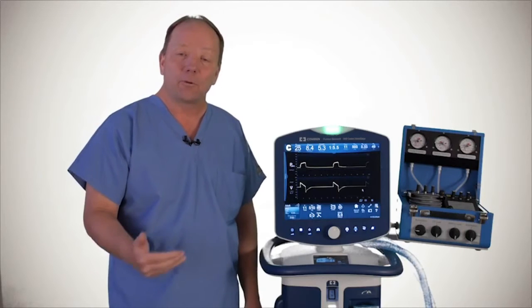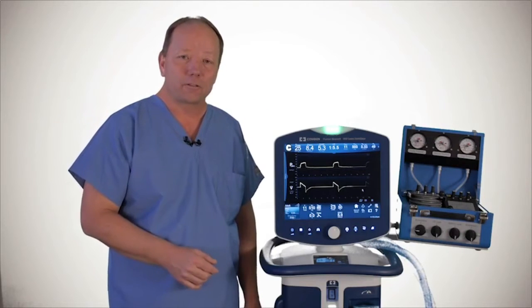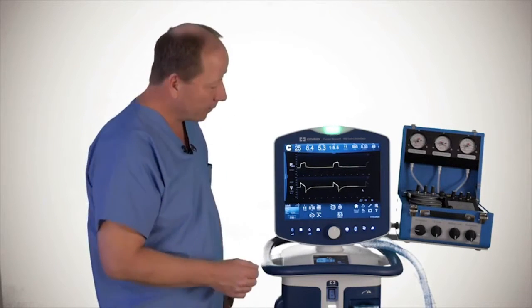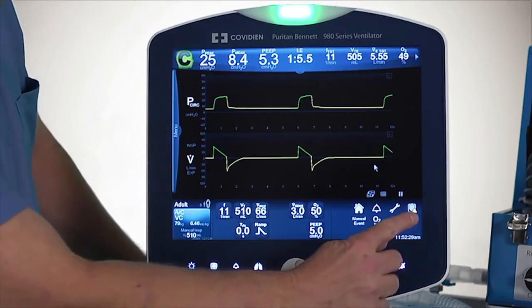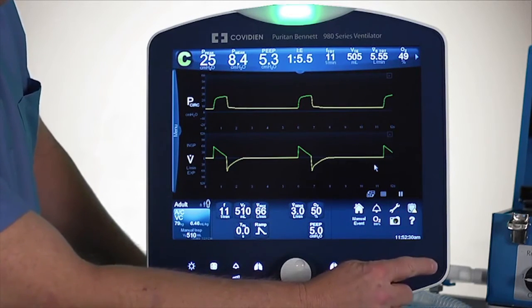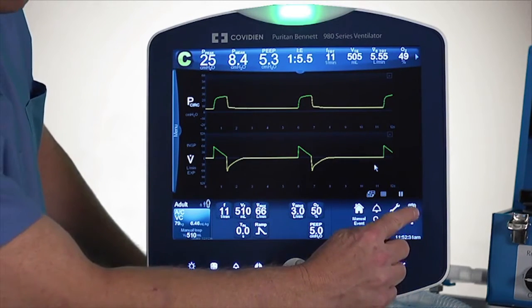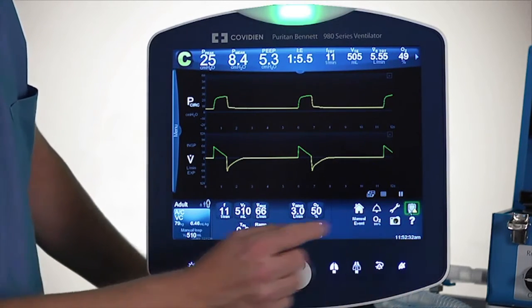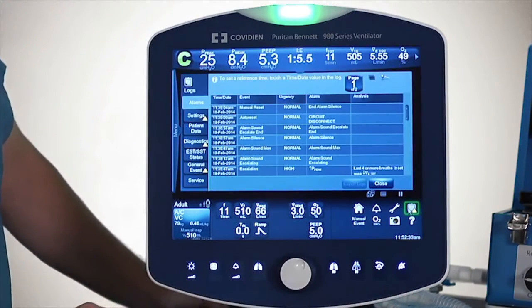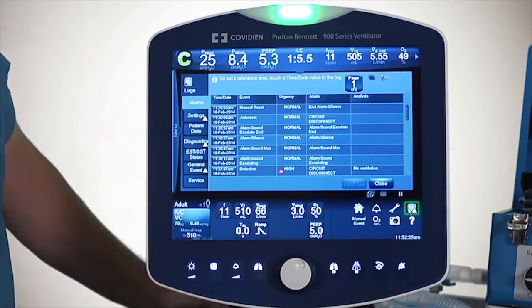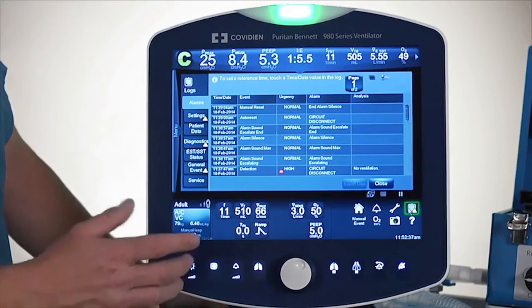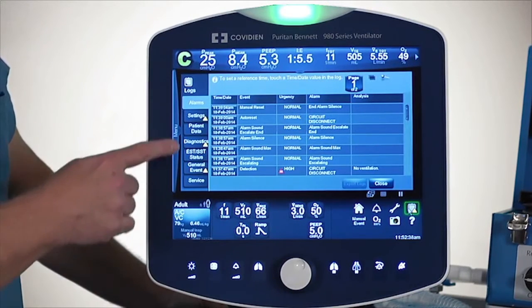The last thing I want to cover is the logs. Let me go down to the logs over here — that is this little clipboard on the lower right-hand side. I mentioned that we have alarm logs, but we also have a number of other logs that may be important to you.